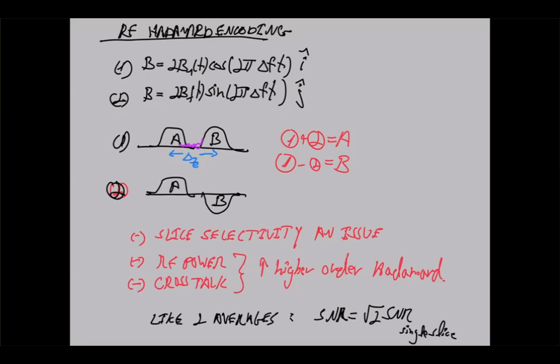Okay. However, if you remember what we talked about with SNR, right? SNR is proportional to the A to D time. Now, as opposed to the previous case where you excited a slice and you just observed it, here, when we excite these two, the data that we collect with Fourier encoding has information from these 2 slices together.